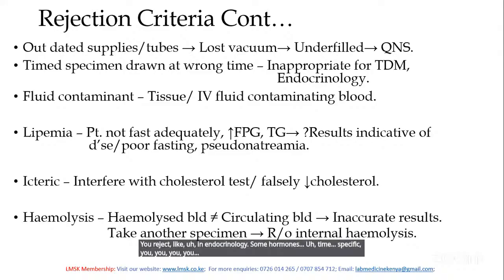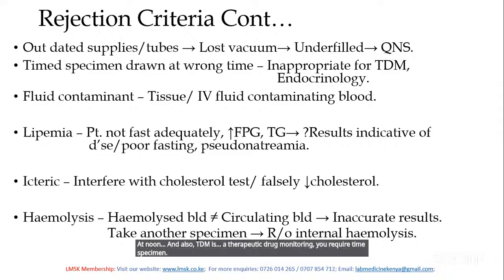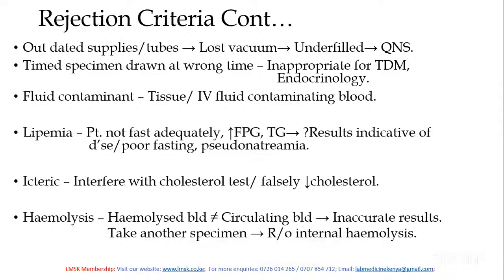You analyze them in the morning, at noon, and also TDM, therapeutic drug monitoring, you require a timed specimen. Then fluid: when there's fluid contamination from the tissue or the IV into the blood, you reject, because now the composition of the blood would have been altered.